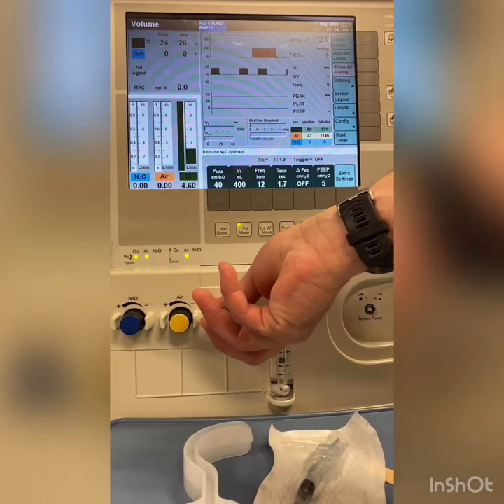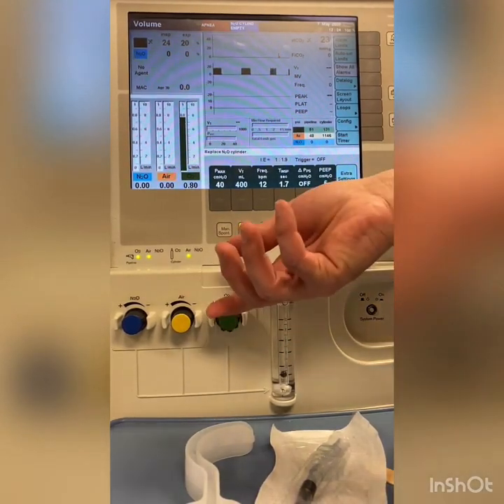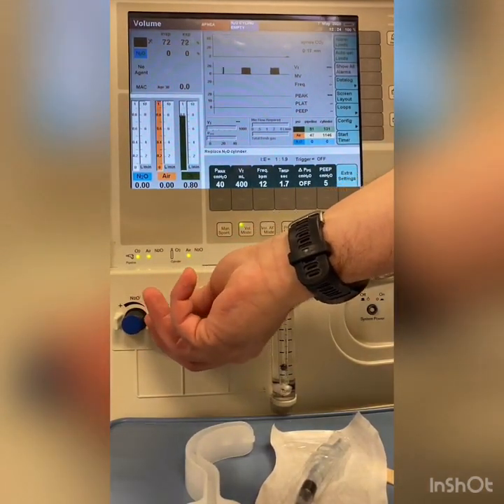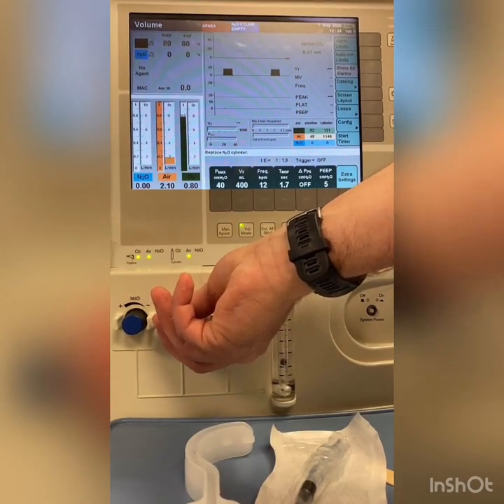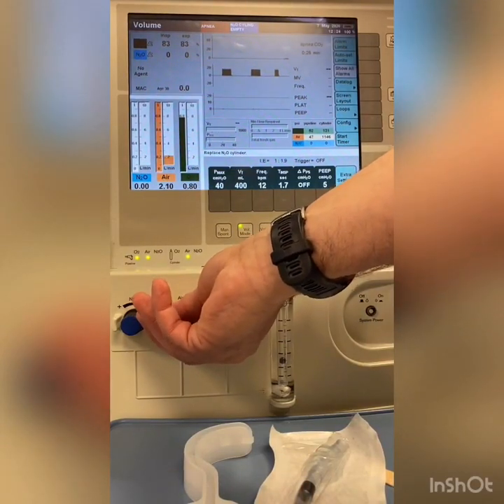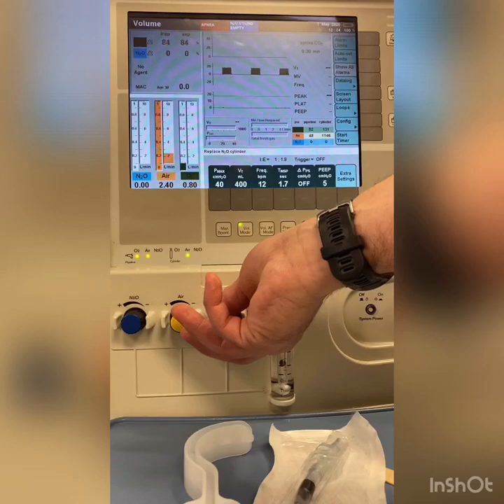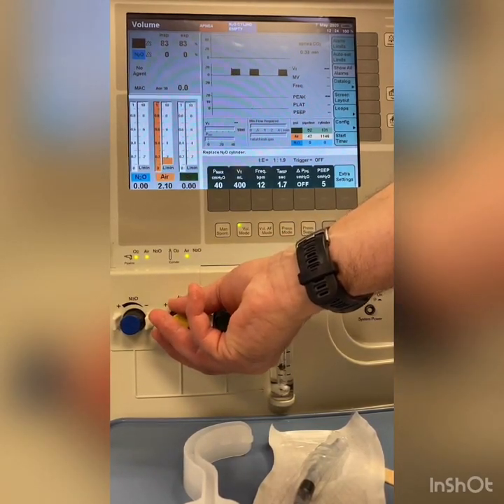Now, did my patient come to me on oxygen? No, it's a healthy patient. They came to me on 21% oxygen. Let's give the patient air, right? Medical air. So if I want 2 liters flow, I can go ahead and do 2 liters of air and turn off my oxygen. This might make you a little bit nervous, saying we got to have some oxygen.